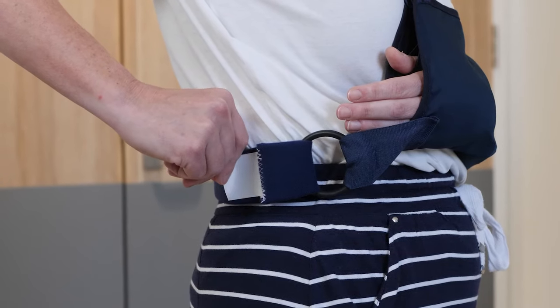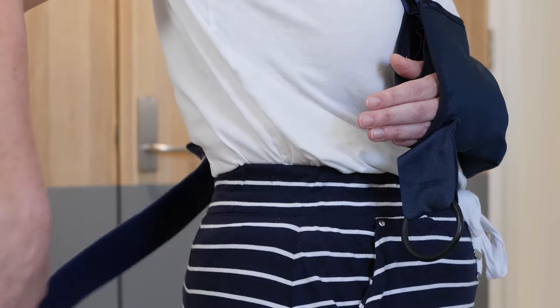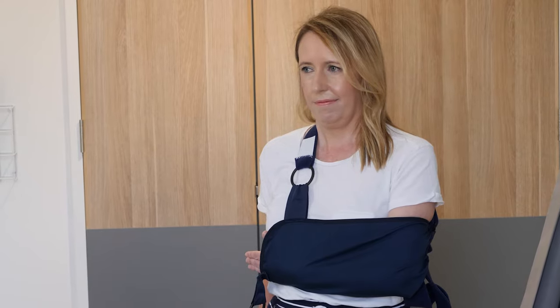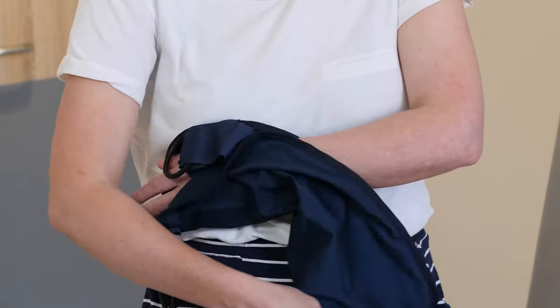To remove your sling, undo the side strap velcro tab and release the side strap from the ring. Use your forearm to hold the arm support against your stomach. Undo the wrist strap velcro tab and release the shoulder strap from the ring. Remove the arm support.